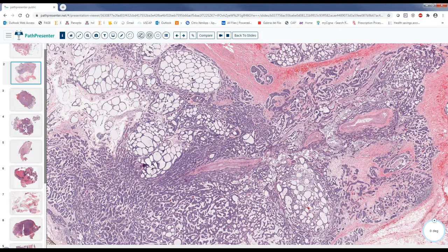Okay, but having a small sample, especially in core biopsy, I'm talking about it because most of what I do is small core biopsies. That's what I get, and most of the time even fine needle aspiration. So you have to get ready to evaluate tumors that are very tiny. Especially these days, minimally invasive procedures are the most important ones. When you have plenty of tissue, you can do whatever you like to do.